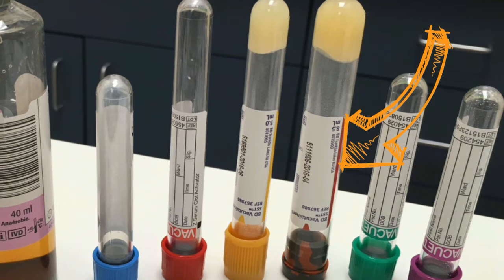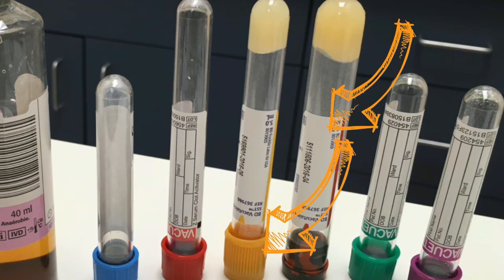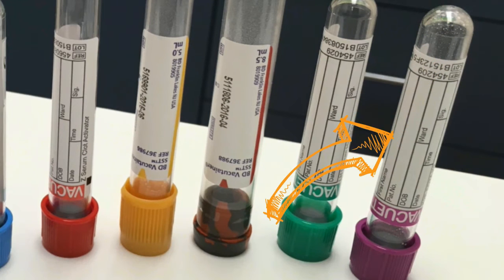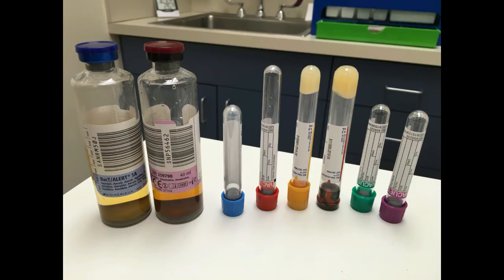The yellow Integra tube contains a gel separator that you must allow to clot for half an hour. These test for CMP, BMP, including a cardiac panel, TSH, free T4, and PSA. The green tube contains a heparin coating. It is used to heparinize plasma or whole blood for special tests. The purple lavender tube contains the anticoagulant EDTA. It is used for most hematological tests, such as CBC with differential.